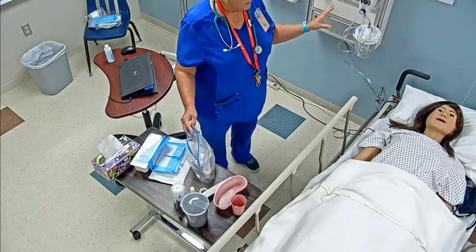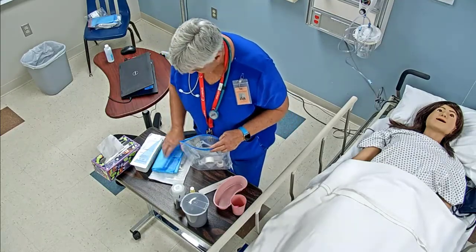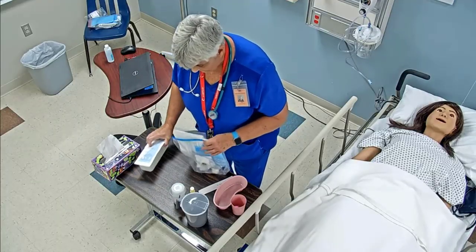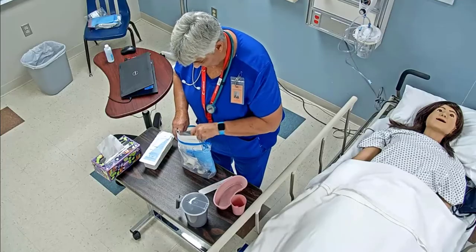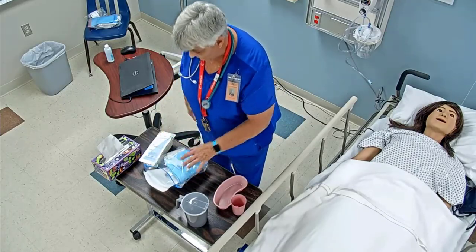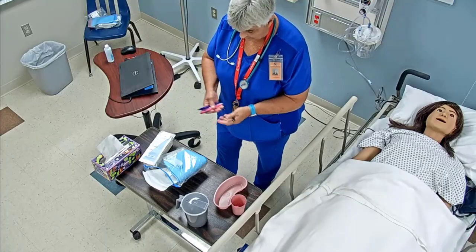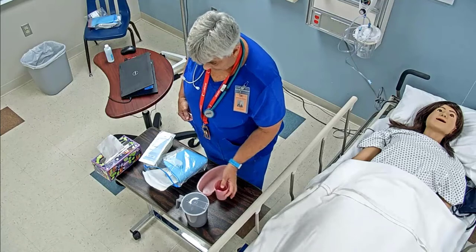If we didn't already, we would get that with us. Okay. I'm going to get all that put back in here. So once I have all of my supplies, like I said, we needed good lighting, and also I need a pen light. I've got my stethoscope, and I need a marker. This is a permanent marker, so that we can check our measurements and stuff. So I've got all of those supplies.